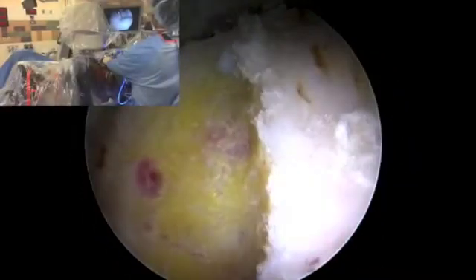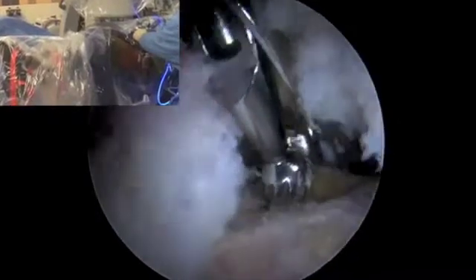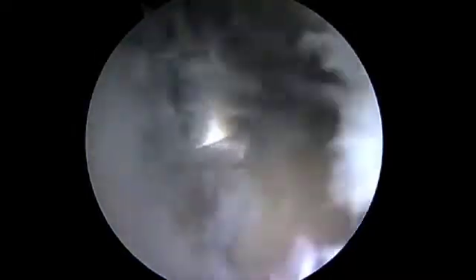In order to access the inferior aspect of the CAM lesion through an interportal capsulotomy, the hip needs to be flexed in order to relax the capsule and bring the inferior CAM lesion into the working space of the interportal capsulotomy. The trough is connected between the borders of the superior and inferior aspects of the CAM prominence.